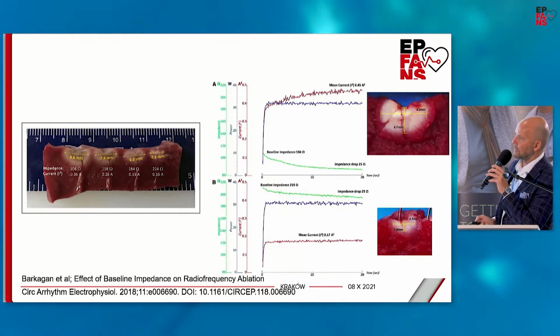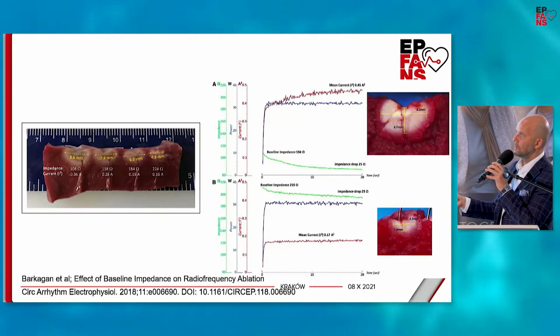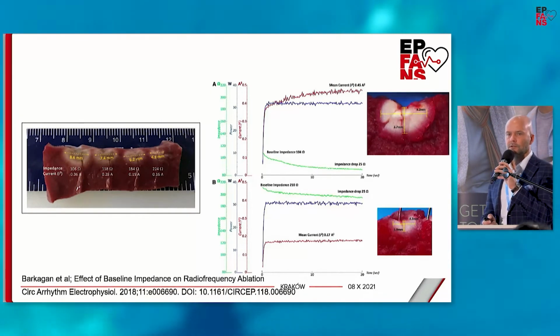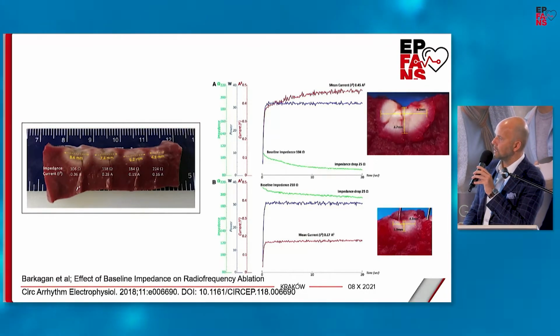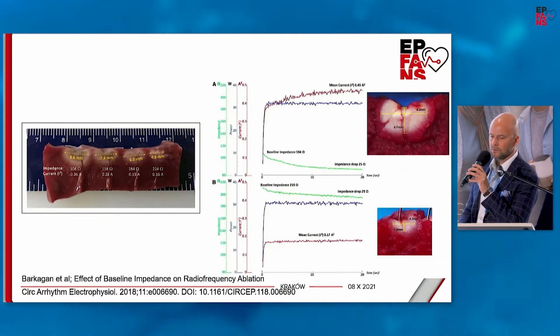So please remember to optimize not only the quality of signals, but also the base impedance. This is also important to observe not only base impedance, but also the change, the percentage change. There is another important issue regarding the impedance.